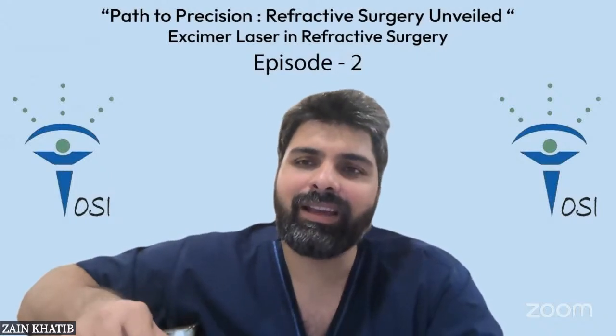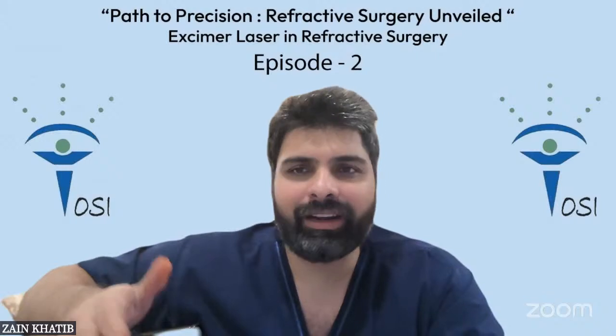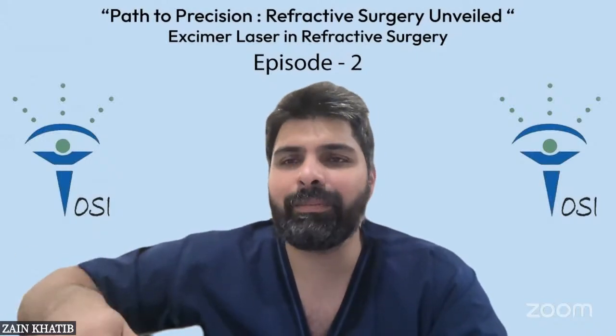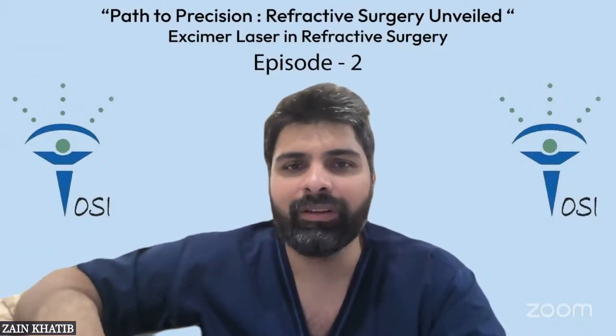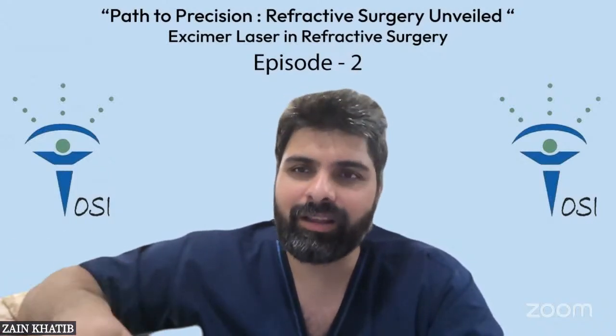So that is the key, I think, to do a good monovision tolerance test. It doesn't always have to be 1.5, it can be 0.75 also, and then you can tell the patient that you will be seeing this much post-op. Eventually, if you do the surgery well and you've done your refraction well, they do see better than what was initially promised.